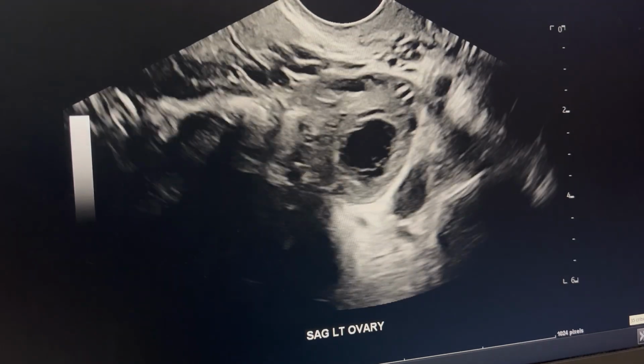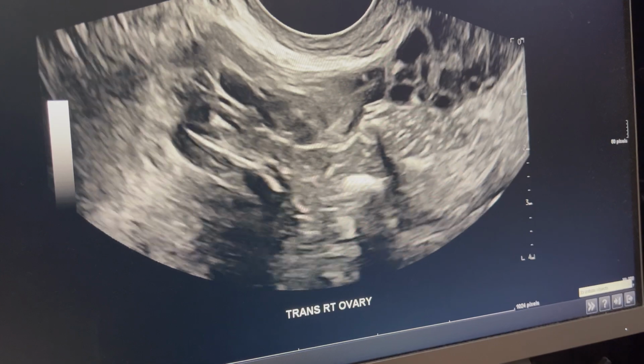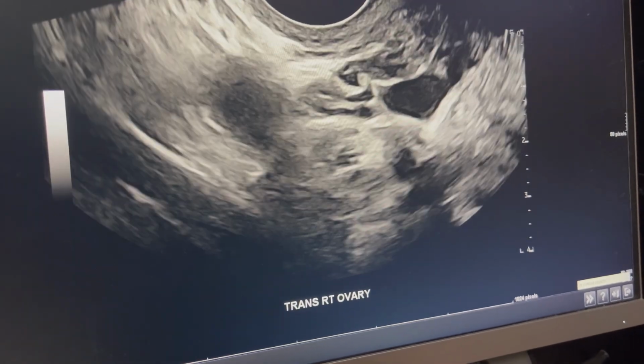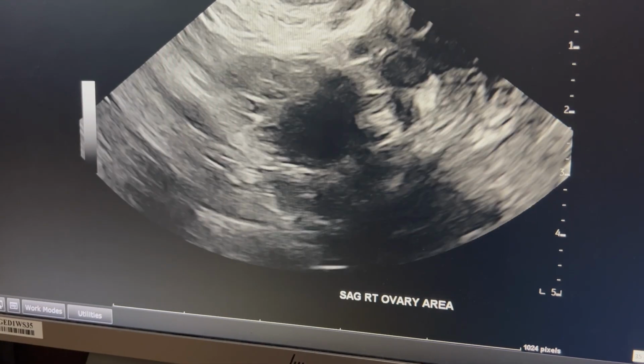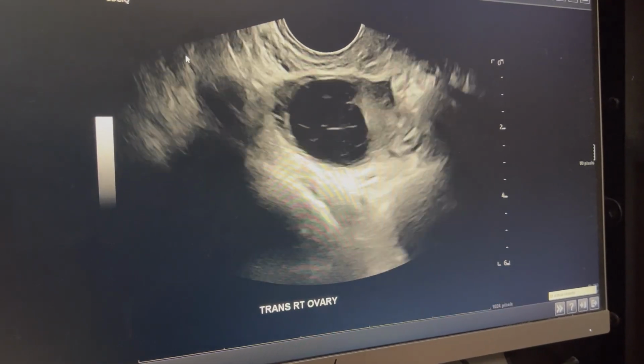It was a long day, and our radiologists usually like cine clips when we do ovarian cyst images, especially if they're complex and not simple. And if you guys don't understand that, it's okay. One day you will understand the difference between simple and complex cysts.